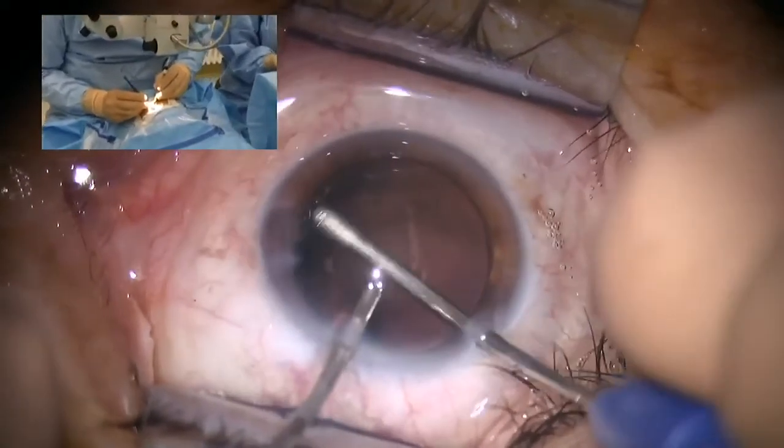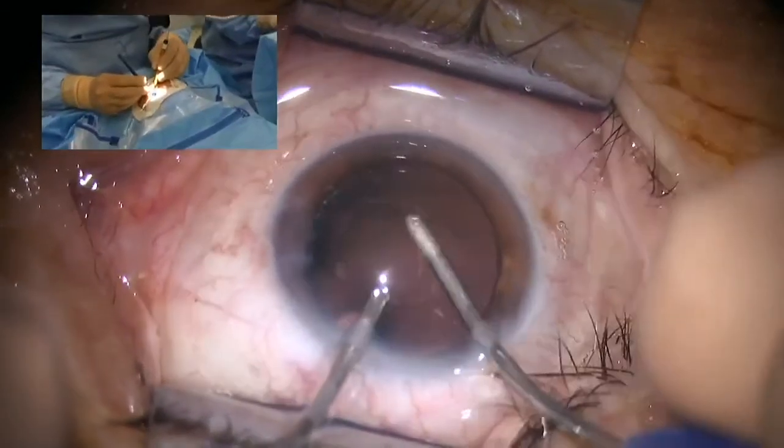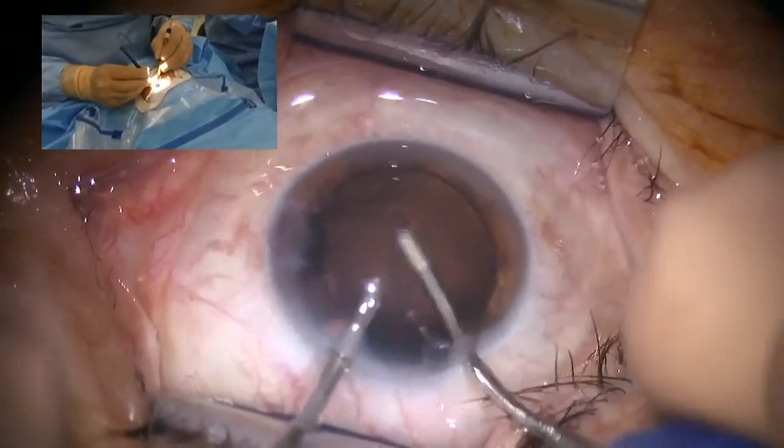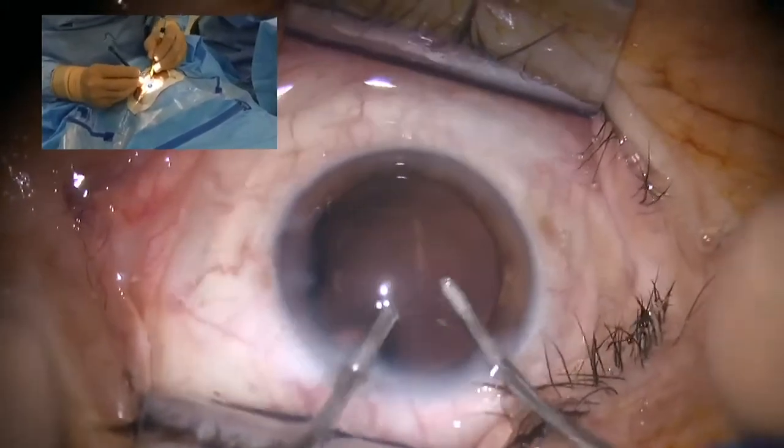Removal of the cortex and the fibers left in the capsular bag. There is a small part here as well.